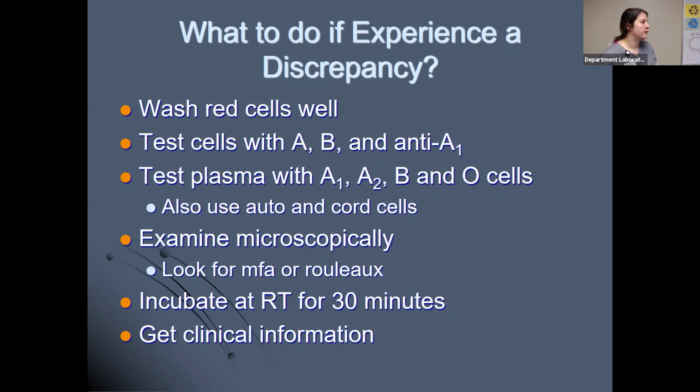Patient identification is very important too. Oftentimes, this happens a lot, just to give you a heads up in blood bank. Females change their names, they get married, all right? So you might have a previous history on Jane Smith, then you receive a specimen, she is now Jane Cooper, all right? So you're doing testing. Every specimen that we receive in blood bank, we do a historical check on. We will look them up. You can look them up by name, you can look them up by medical record number.